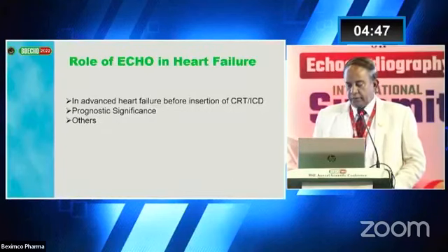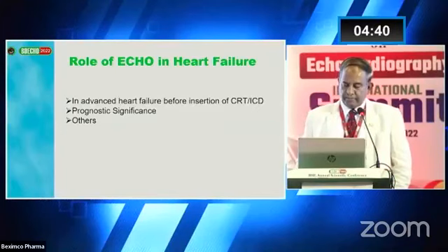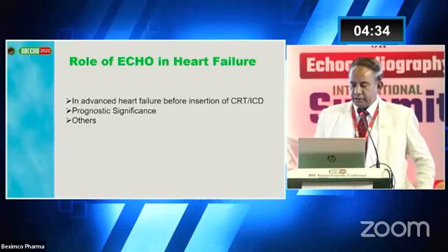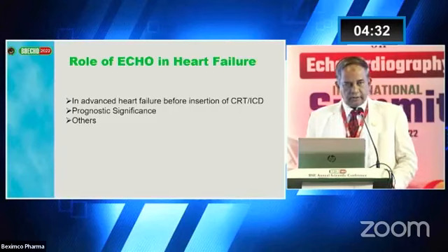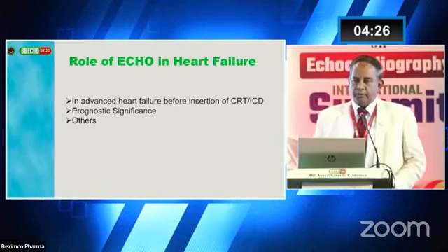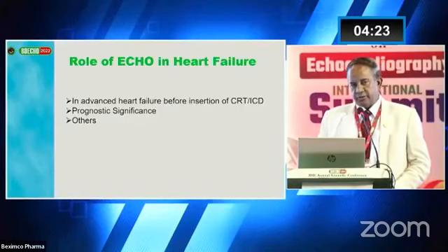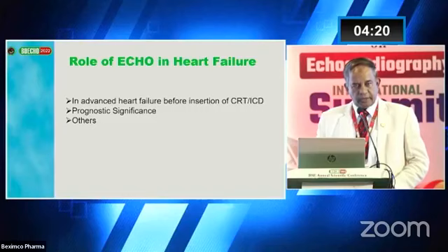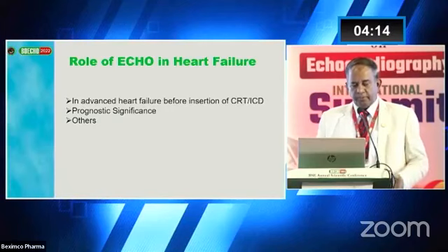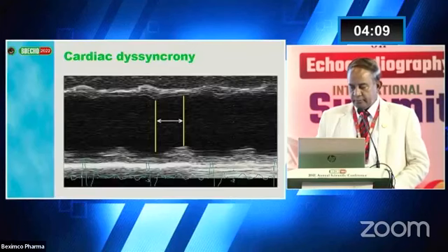If we consider echo in heart failure, a lecture was already given by our Professor Sabina Hashem. In heart failure echocardiography, mainly two things we consider: one is LV function, and another is end-stage heart failure, where we have to consider CRT-D. In CRT-D, there is dyssynchrony. We can do echocardiography, and after putting in the CRT-D, this may go back to normal. This is important in intervention. These are the dyssynchrony.